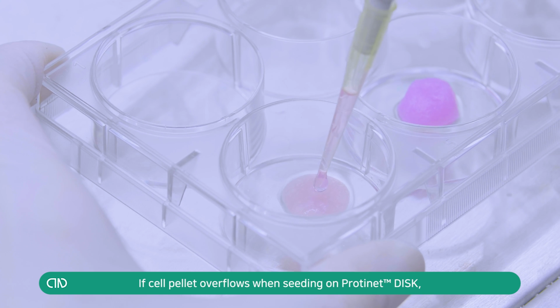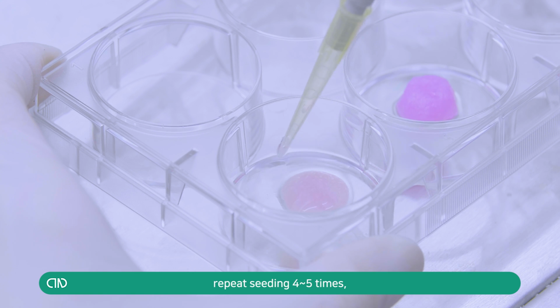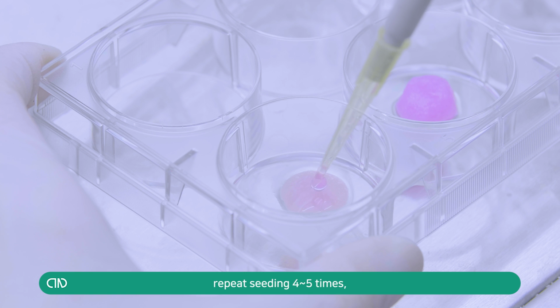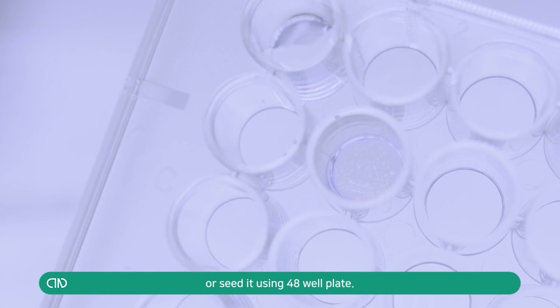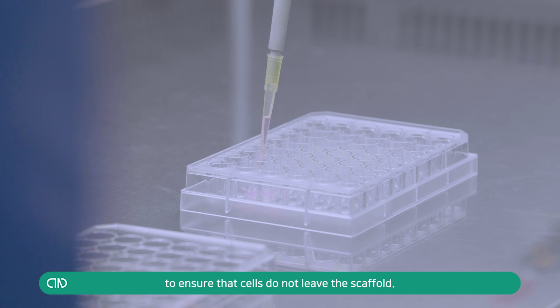If the cell pellet overflows when seeding on the Protinet disc, repeat seeding 4 to 5 times, or seed using a 48 well plate. Be very cautious throughout the experiments to ensure that cells do not leave the scaffold.